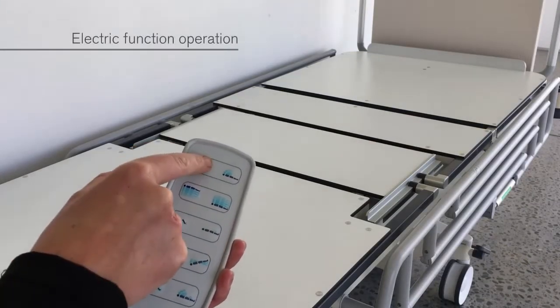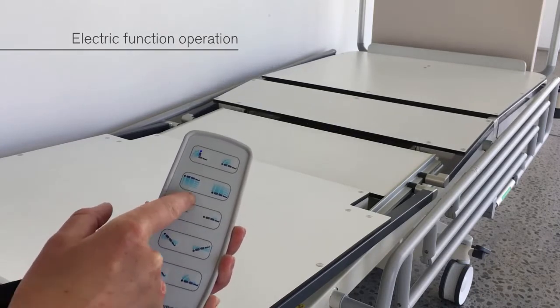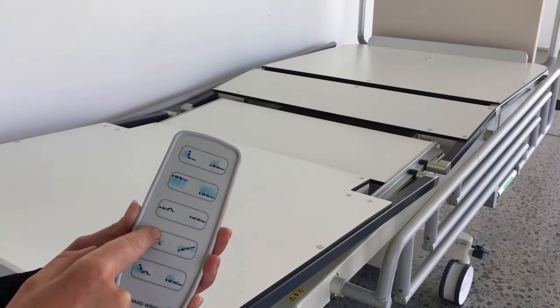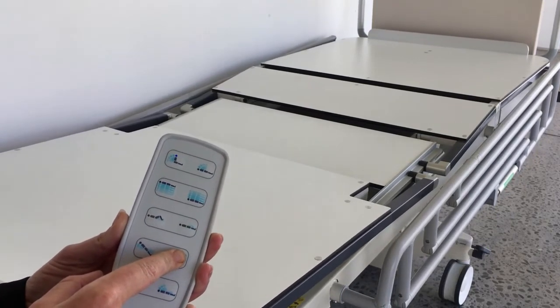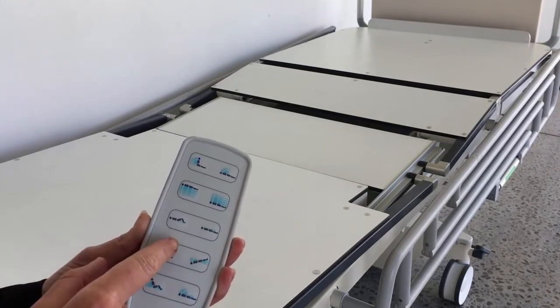To raise and lower the backrest, upper leg raise, or the deck, press the appropriate button. To tilt the deck, press the head up or head down tilt button. When transitioning from head down to foot down tilt or from foot down to head down tilt, the deck will pause at the level position before continuing.